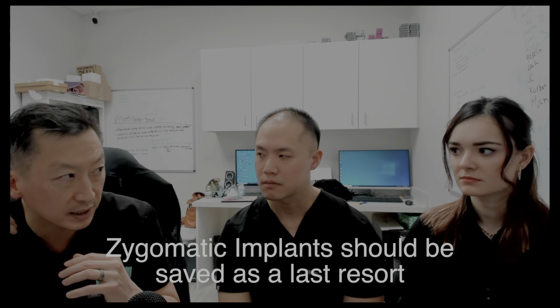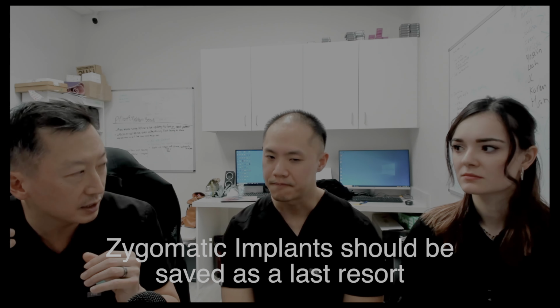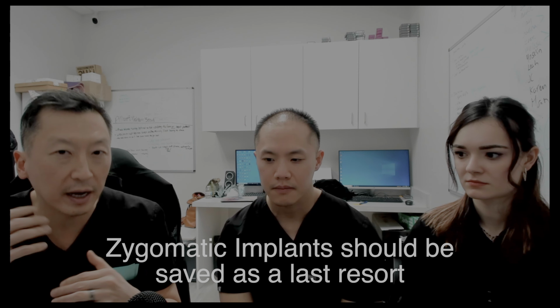And you brought up a very key point. I believe you agree on the same thing, that zygomatic implants, zygomas need to be saved as a last ditch. If you are elderly, then it is a great option to bypass and save another surgical procedure. If you're younger, then with everything I know about all on four, if you're dealing with my mouth, versus heading straight to a zygoma, I would say, hey, you're doing a sinus lift and implant on me and pterygoids. If I had sinuses that look like this, that's what I would say. Now his sinuses were very large, so he might have to go straight to a zygo.